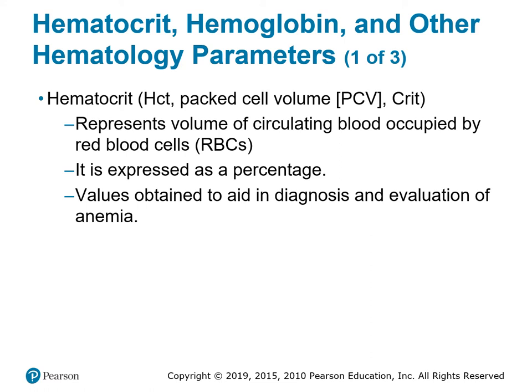There's a sliding mechanism. I'm going to try to find a picture and show it to you all. Put the capillary tube on there. You will slide the reader to where the red blood cells begin. You will push the button to mark it, and you will slide it all the way over to where the red blood cells meet the serum. Push that again, and then from where the red blood cells and the serum meet, to the end where the serum meets. All right, and you have to record those levels. They have to be within a certain range.